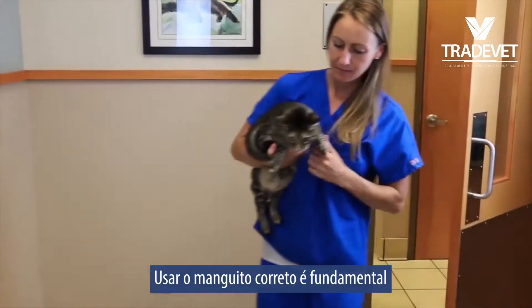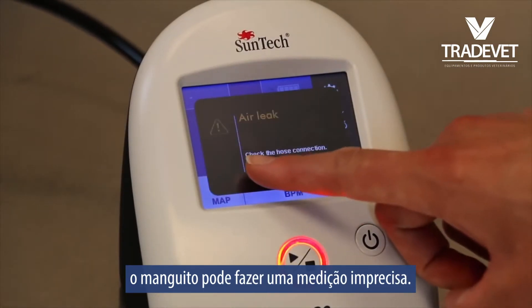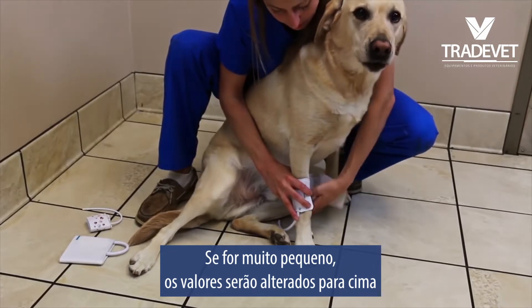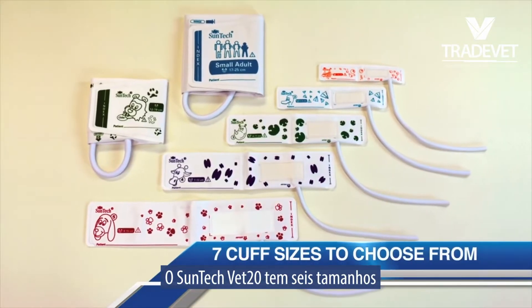Using the correct cuff is a vital part of taking a blood pressure measurement. If the cuff is too large or too small, an inaccurate measurement may occur. A cuff that is too small will shift values up, and a cuff that is too large will shift values down.